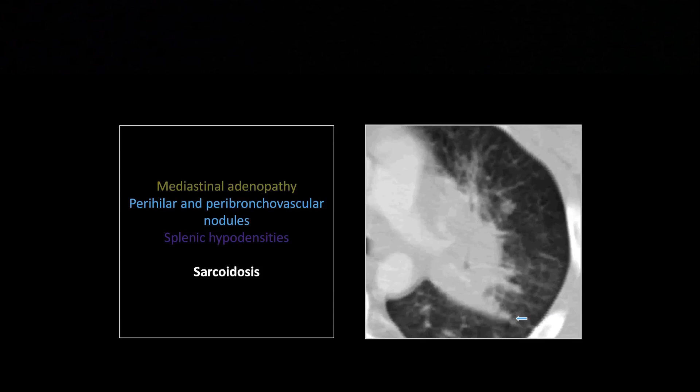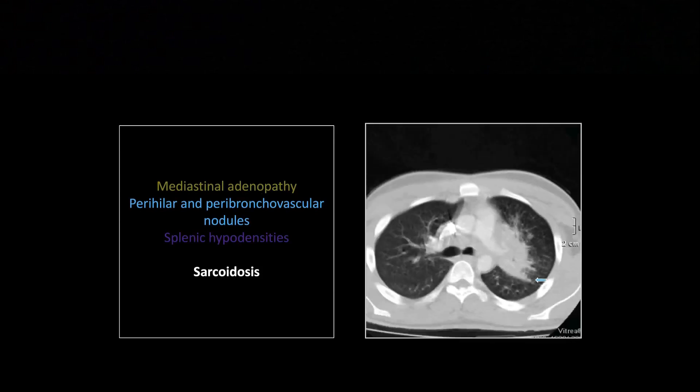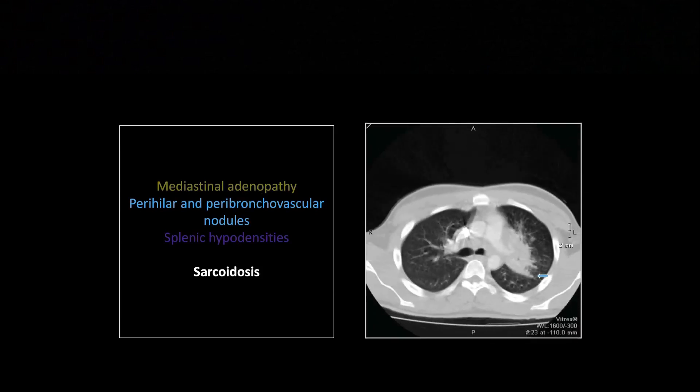When I start thinking, is this sarcoid? I go and try to find subpleural micronodularity, because that will seal the deal. Peribronchovascular involvement is the other classic. If you look to the anterior portion, you can see that density is tracking out along a bronchovascular bundle — that's very helpful and has the same essential significance as subpleural nodularity. So you've got adenopathy and subpleural nodularity: pretty good for sarcoid.